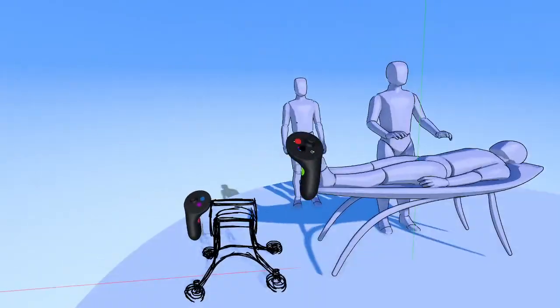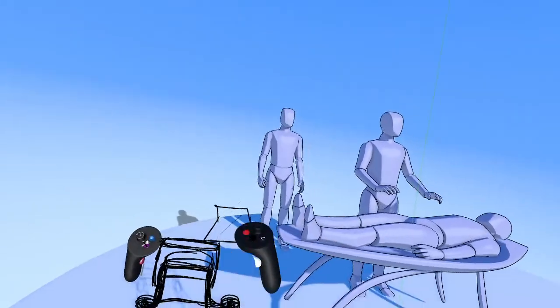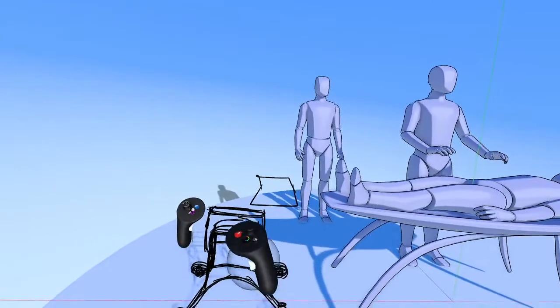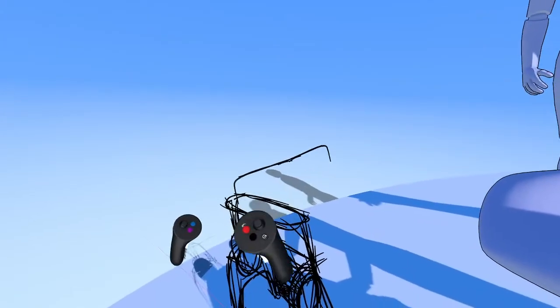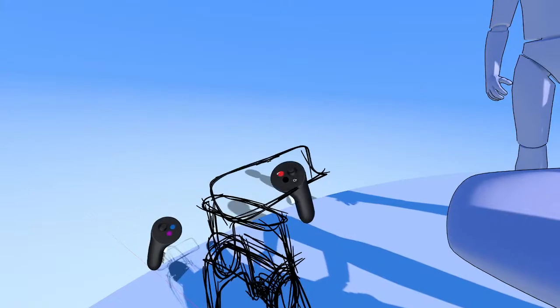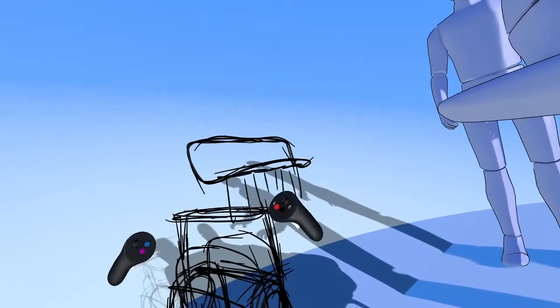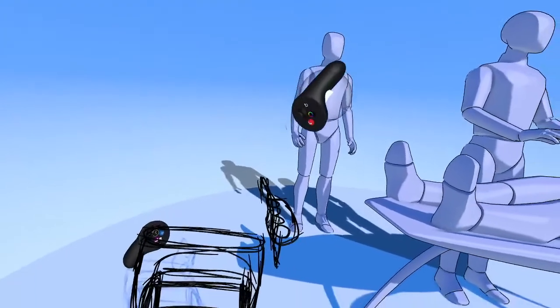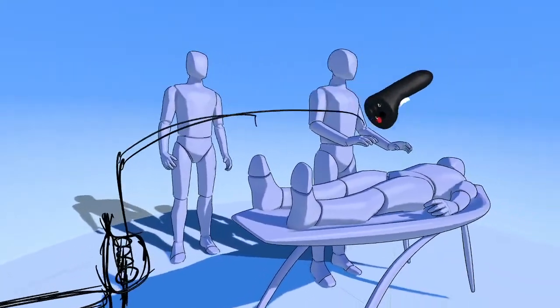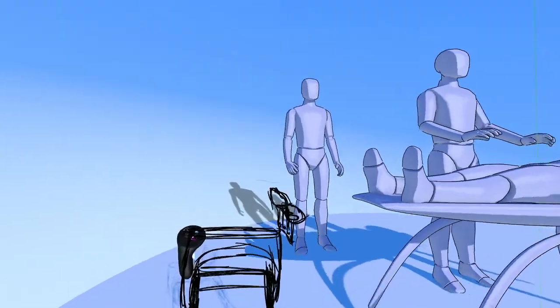Okay, so I think one thing that would be important to have is a tray for, maybe not the tools for the doctor or the surgeon, but the tools for the machine. So maybe it doesn't even look like a tray and it looks more like a shelf like this. And then there's sections that hold the different bits that it's going to use, like that. And then the arm can just drop in here, grab a new bit, take it, and start to use it. So yeah, this looks pretty decent. We can think about that idea.